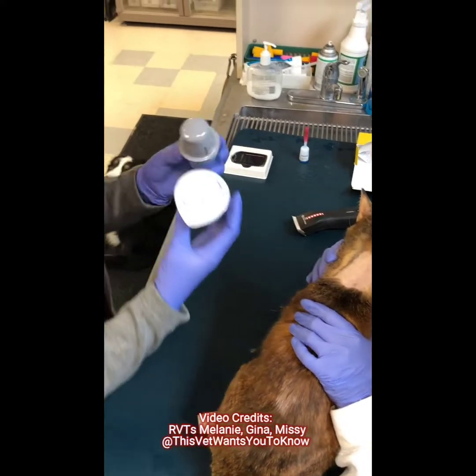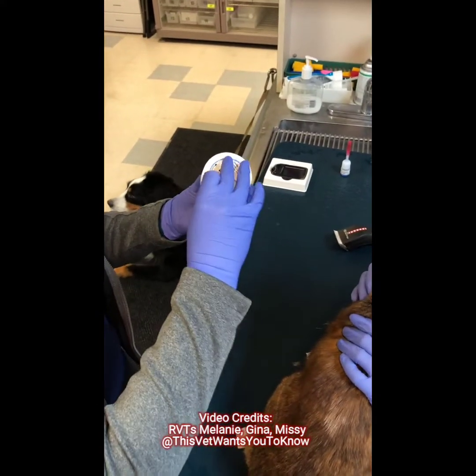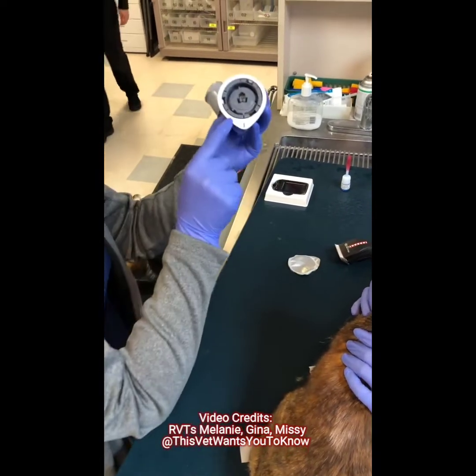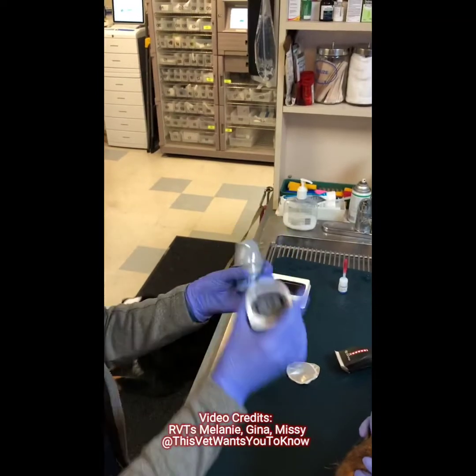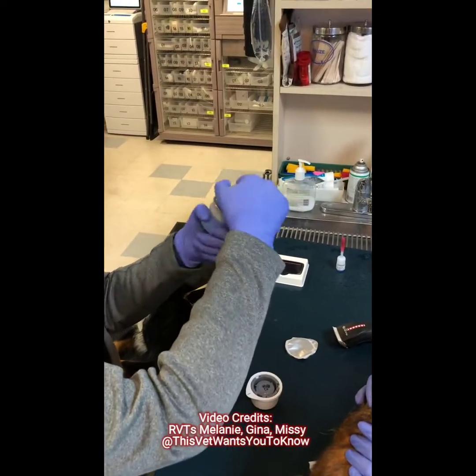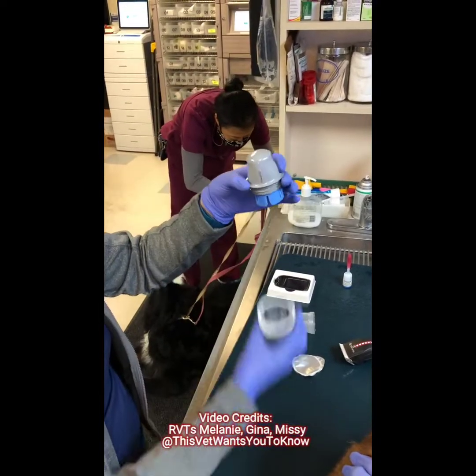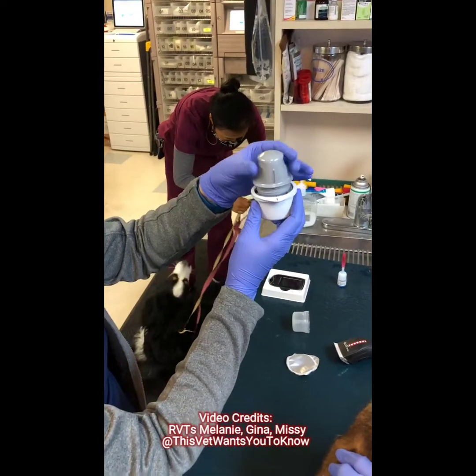It comes in two pieces. We're going to tear this lid off — you'll see that it has a line on it, and then this one twists off. You take this piece, line them up together like that, and snap them together.